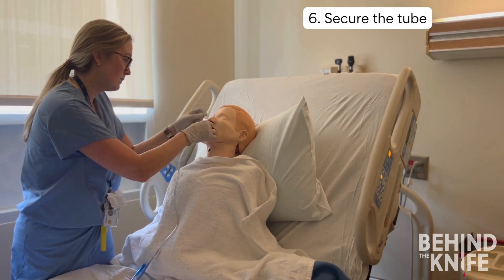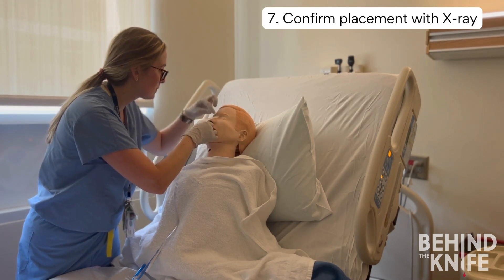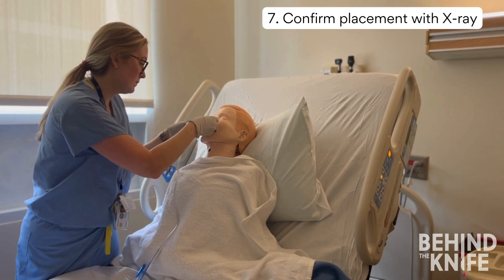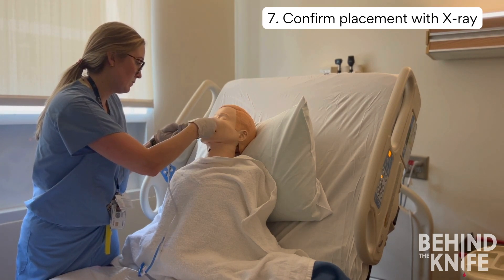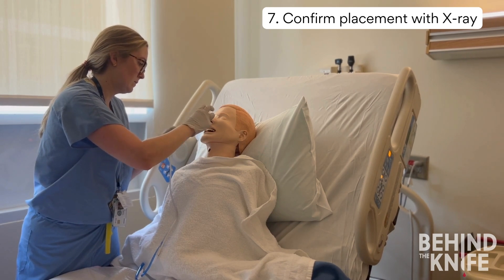Once the tube is fully inserted, you can secure it with tape. You need to obtain a thoracoabdominal x-ray. Sometimes you will see team members pushing air through the nasogastric tube and using a stethoscope to listen for bubbles over the stomach. This technique can also be used for confirmation, but given the variability in physical exam, it is often safer to confirm with radiographic imaging.